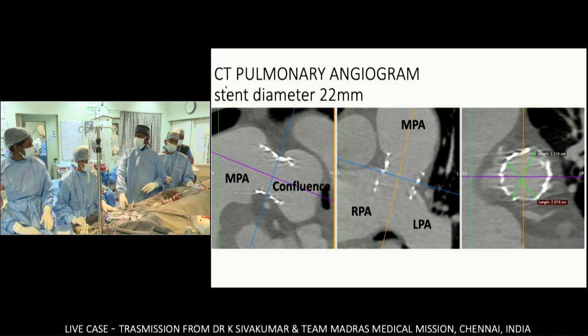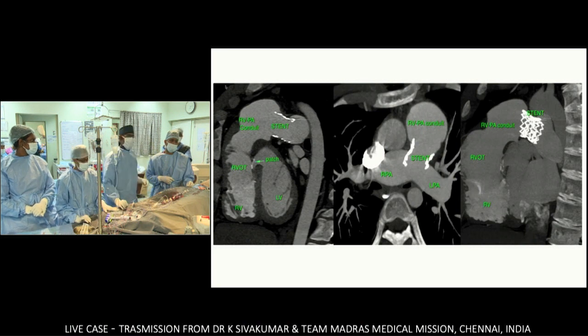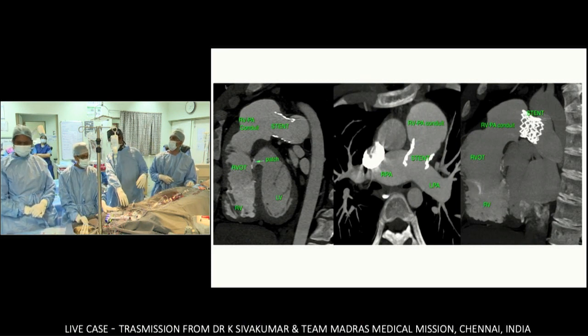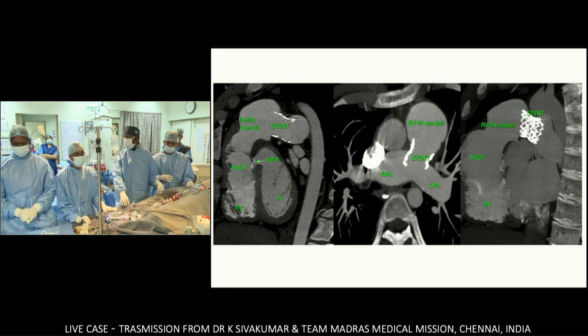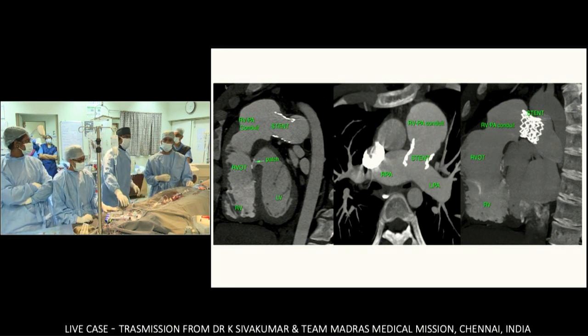Now, when I was in the other lab, my colleague Dr. Pramod was working here, and he did the basal hemodynamics. Pramod, what was the number? RV was 58 and distal PA was 28. So there was a 30 gradient across the pulmonary homograft.